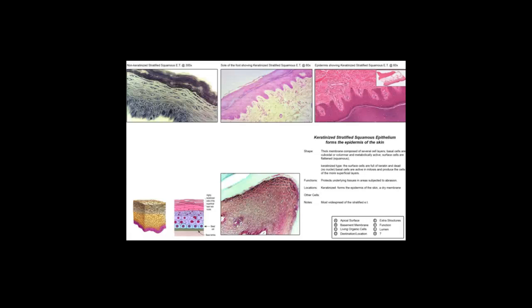One cell type that's producing the pigment melanin, called melanocytes, and the other abundant type of cell we find here would be the keratinocytes that have been previously mentioned. Keratinocytes are the only cells that can leave this bottom layer and be found in each of these layers outside of the basal layer. This is thin skin and would often be associated with hair follicles, since we are mammals.